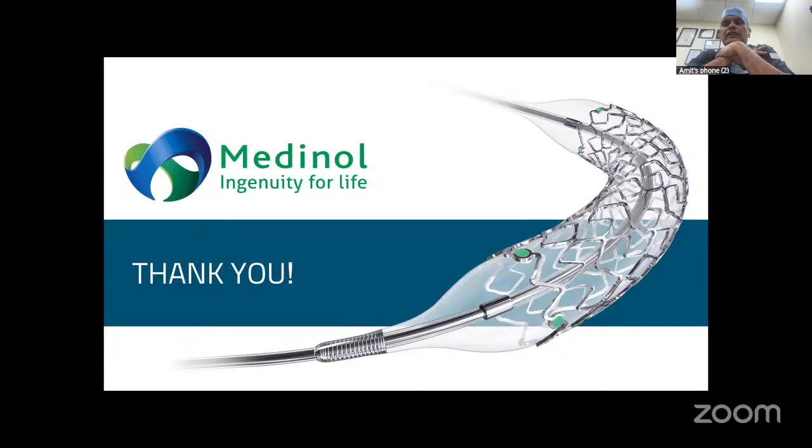So I just want to ask one thing. What about the radial strength? You are telling it's all closed cell design, or open cell design followed by closed cell design in some places? Which stent, this stent? Yeah, this is an open type one. But he told it was a closed cell design in his presentation. That is why here it's not like other closed cell type. Okay. Because if it is a closed cell design, then doing a bifurcation is going to be really tough. For bifurcation, it will be useful.